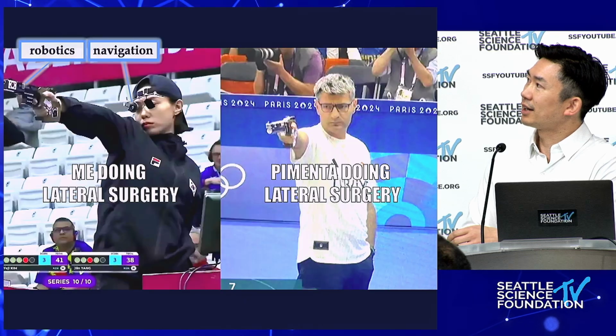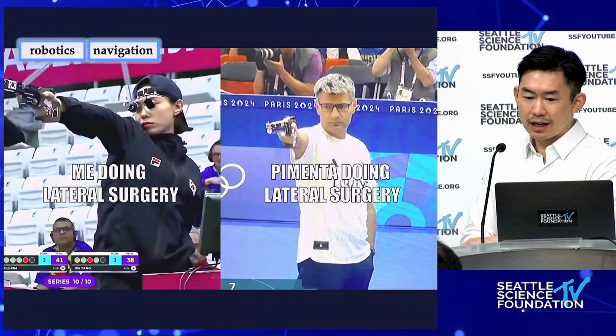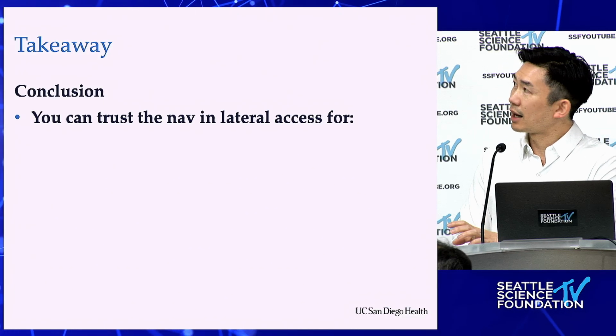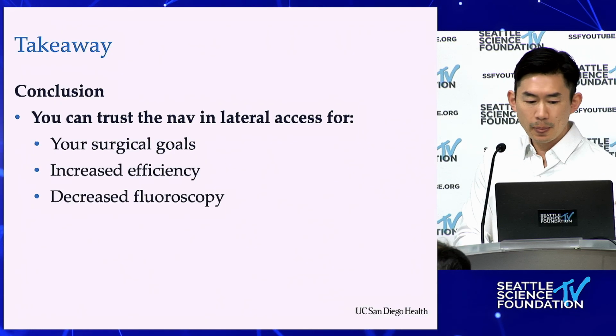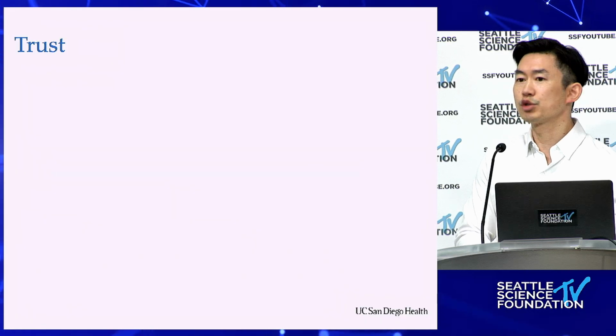I'm talking about navigation. And so when we talk about navigation, I'm going to start with the takeaway, right? And the takeaway essentially is that you can trust the nav in lateral access. And this is going to be for your surgical goals, increased efficiency, and decreased fluoroscopy. And it all comes down to trust, right?